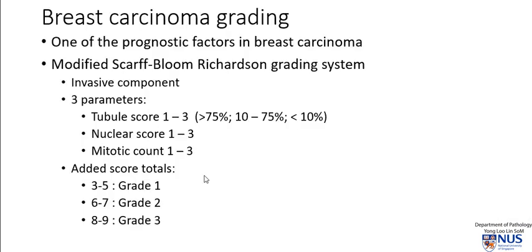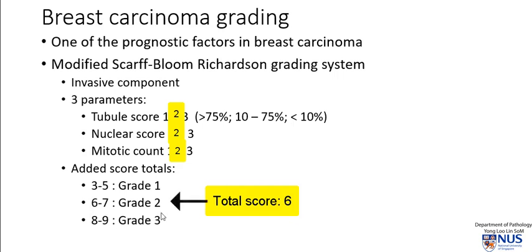Putting this together, we have a tubule score of 2, a nuclear score of 2, and a mitotic score of 2, bringing us to a total score of 6. Therefore, this is a grade 2 tumor. This is how the pathologist grades invasive breast carcinoma.